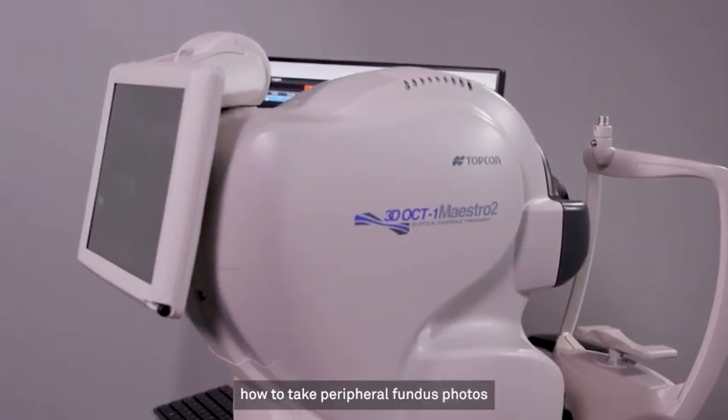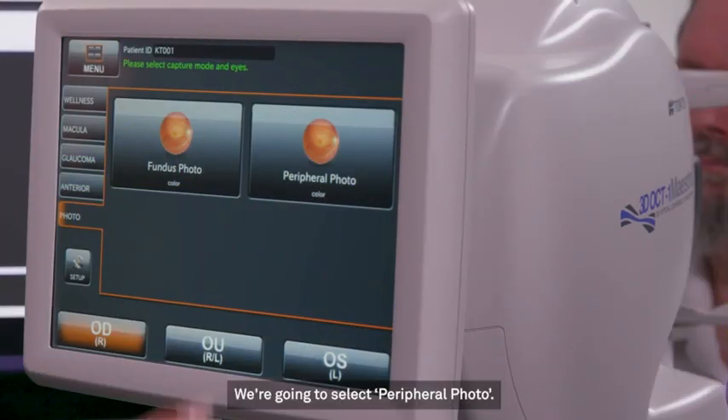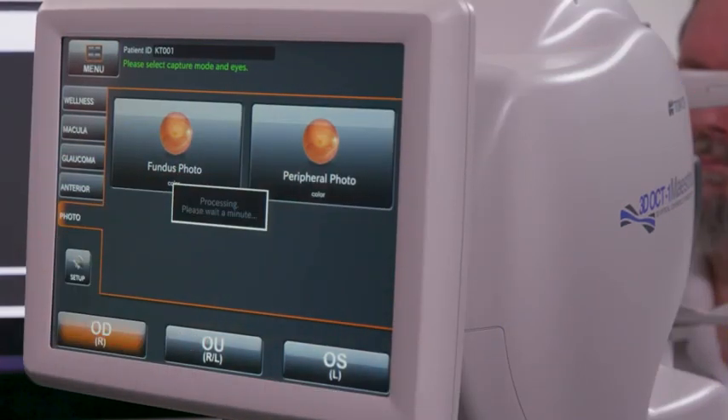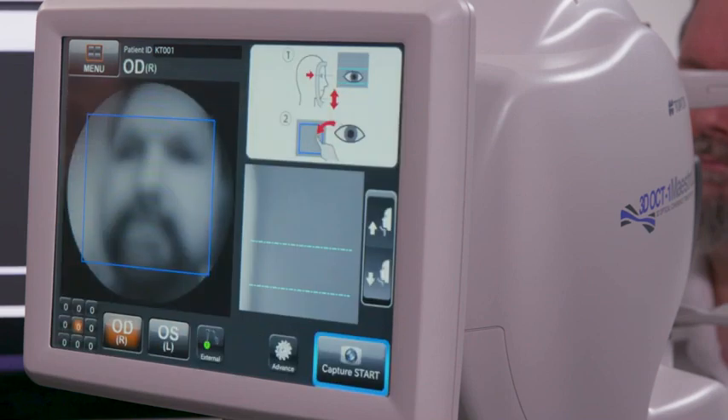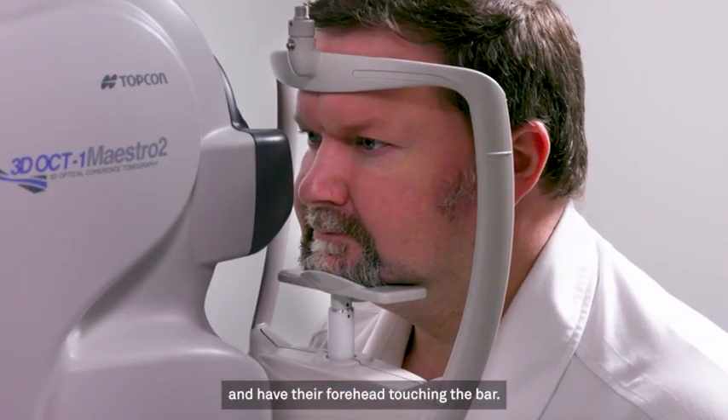Hi, I'm Candice from TopCon Healthcare. Today I'm going to show you how to take peripheral fundus photos using your Maestro 2. We're going to select Peripheral Photo. Have the patient come forward and place their chin on the chin rest and have their forehead touching the bar.